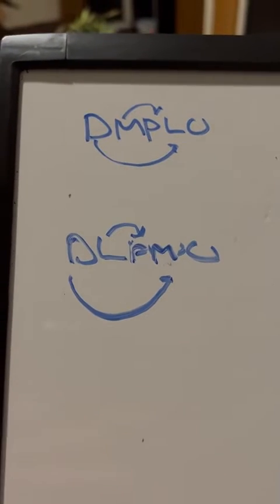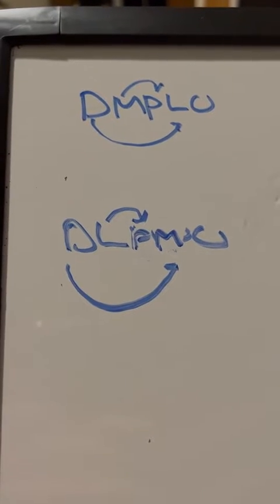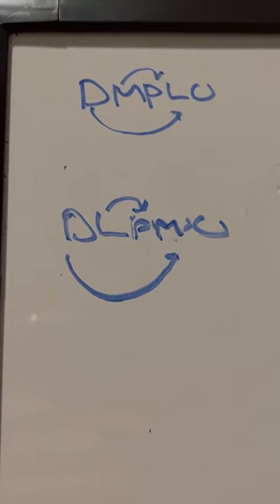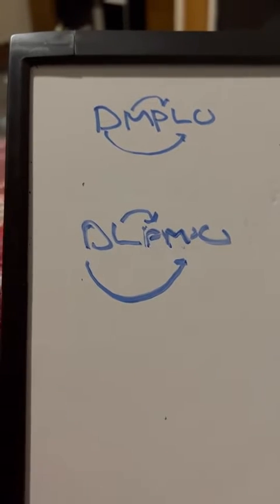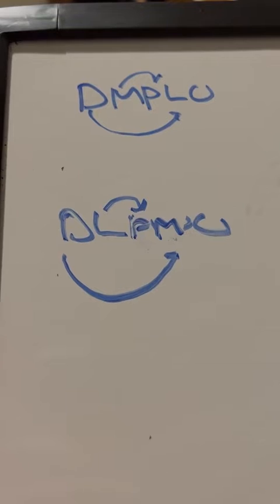So to start this off, when we talk about orthogonal views, the reason we use orthogonal views is to be able to see structures with as little superimposition as possible. We talk about two primary views: the dorsal medial plantar lateral, which I've got listed up top, and the dorsal lateral plantar medial that I've got listed below.